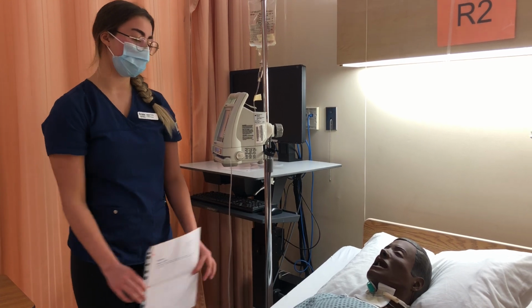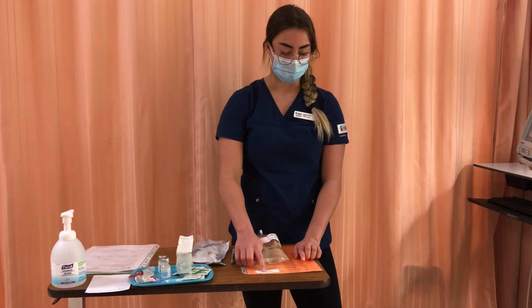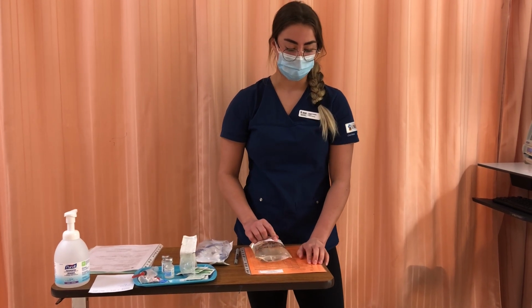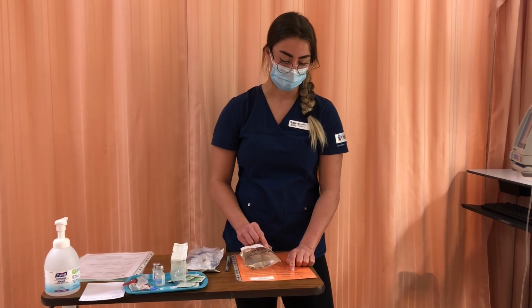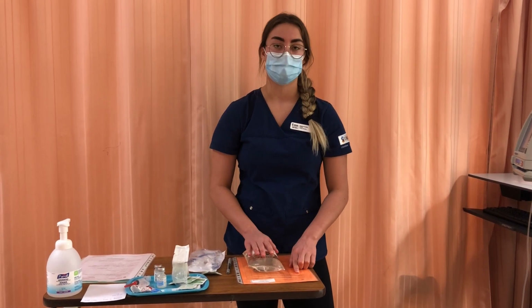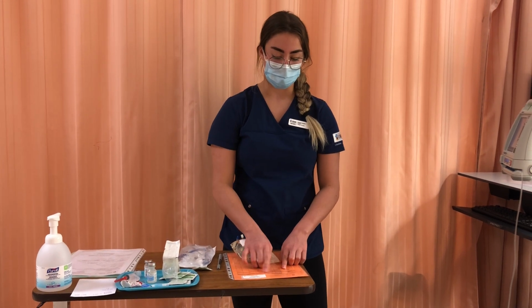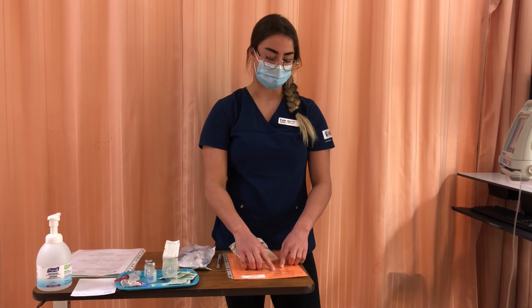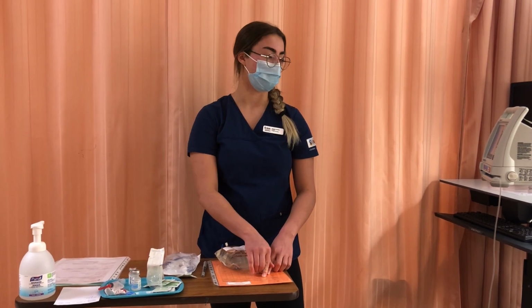Before we get started, I'm going to do my third check of my medications. So we have right patient, Benicio Vines, right medication, Azithromycin, right dose, 400 milligrams, right route, IV. This is an IV mini bag, right time and frequency, daily. It's scheduled for September 15th, 2020 at 0600. There's no signature, no one's given it, and we're within the correct time frame, so I'm okay to give this medication.